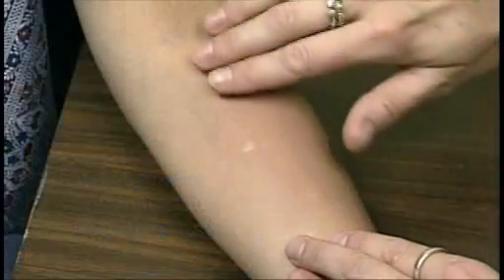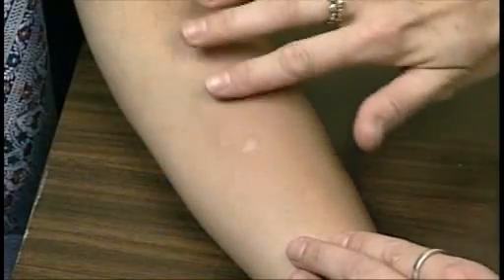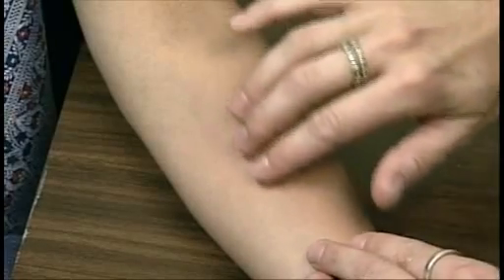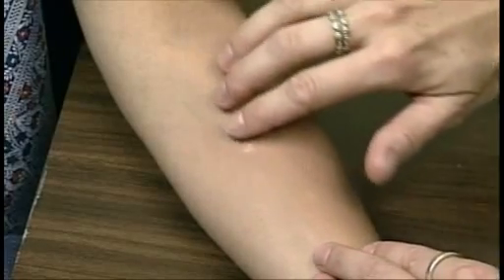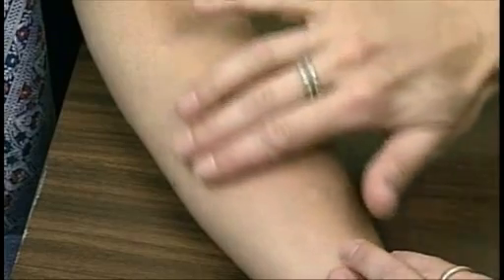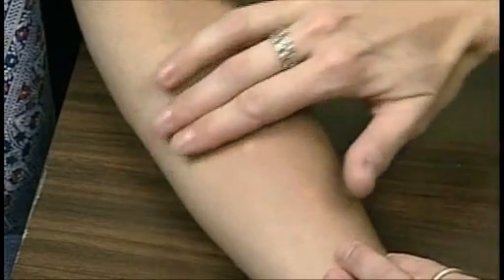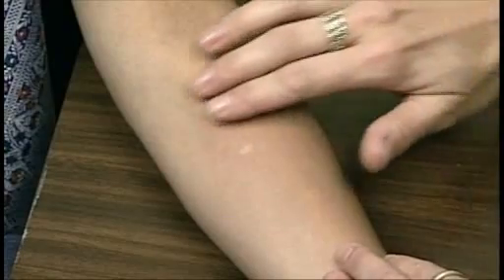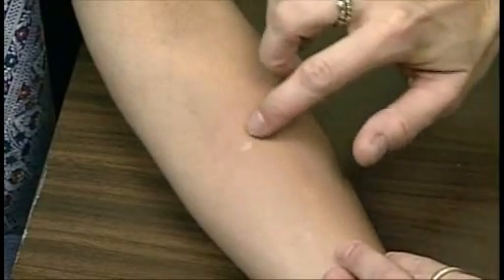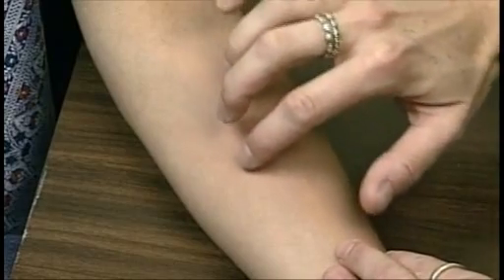Using a light, gentle motion, sweep the fingertips over the surface of the forearm in a 2-inch diameter in all four directions to locate the margins or edges of induration. If induration is present, use a zigzag, feather-like touch over the area to outline the margins of induration.